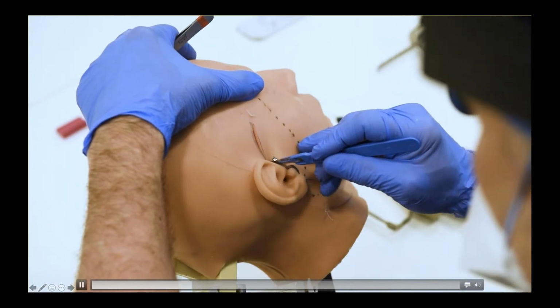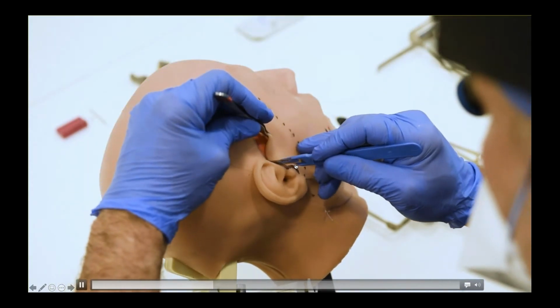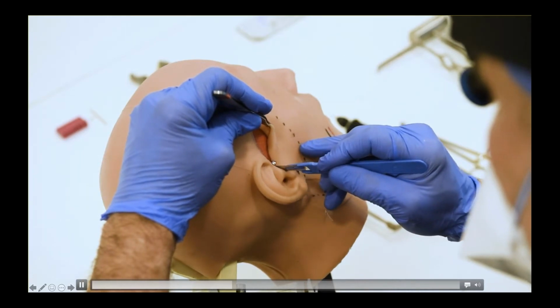You may encounter the superficial temporal artery here to be cauterized.